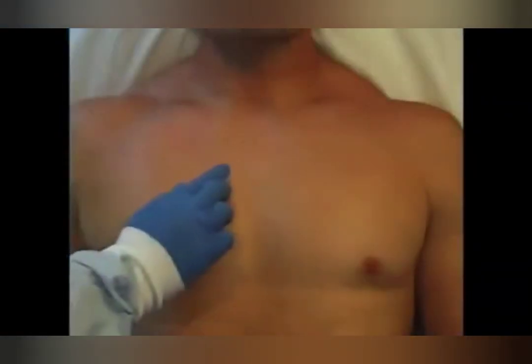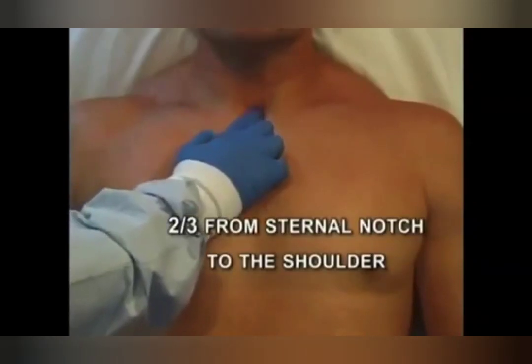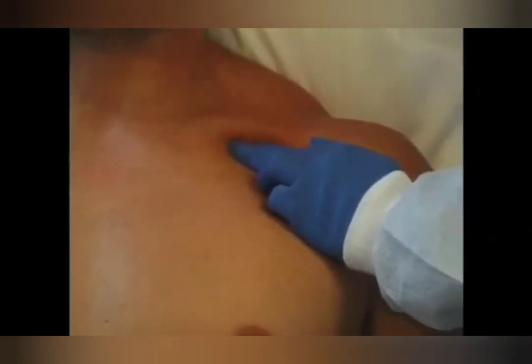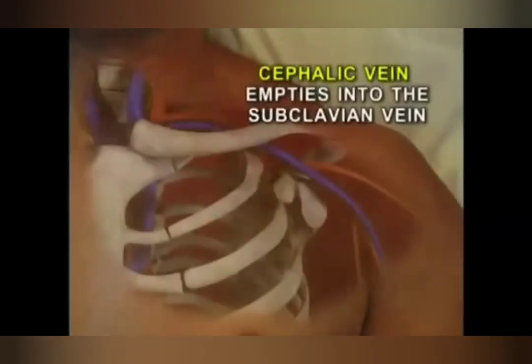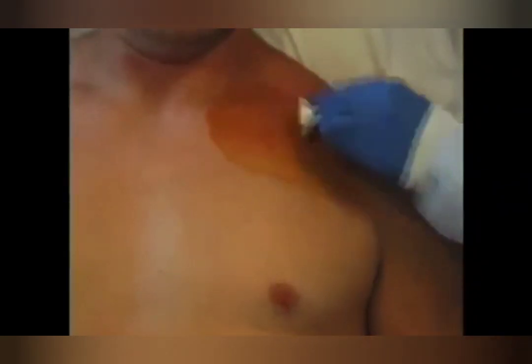The landmarks for subclavian line placement are the point on the clavicle that is 2/3 from the sternal notch to the shoulder. This area may also be noted by finding the deltopectoral groove in between the pectoralis major and the deltoid muscles. It is in this groove that the cephalic vein runs and empties into the subclavian vein. After noting the insertion landmarks, the area is prepped and draped in sterile fashion.